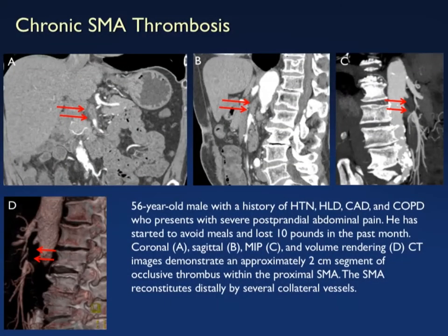Here are a couple of examples of chronic SMA thrombosis, very nicely shown from coronal to sagittal to MIP and volume rendering. You can see occlusion of about two centimeters of the proximal SMA.